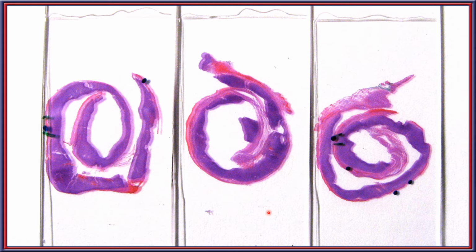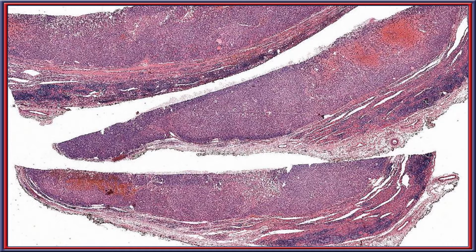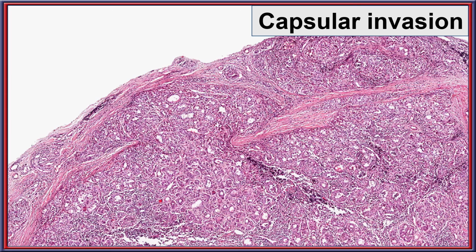It does take a little bit of getting used to, but it is still a method of being able to look at what is going on between the tumor, the capsule, and the parenchyma, and is there any evidence of invasion? And of course, there must be no invasion. So if I think about that, let me just highlight a couple of times.